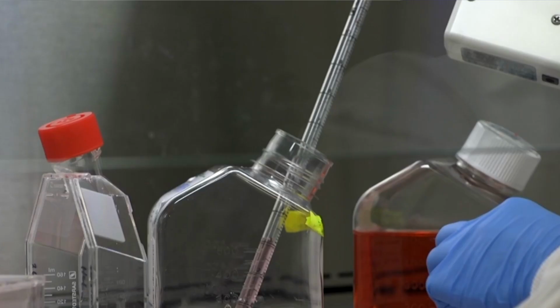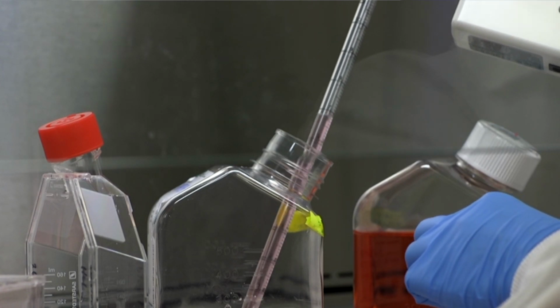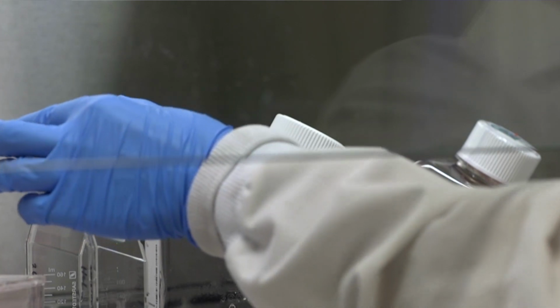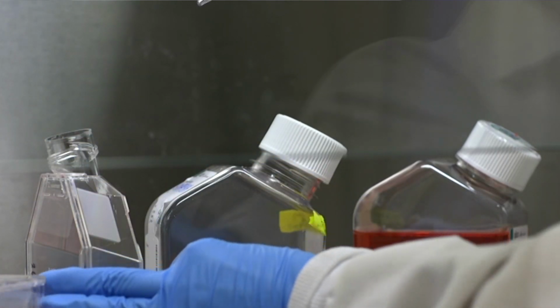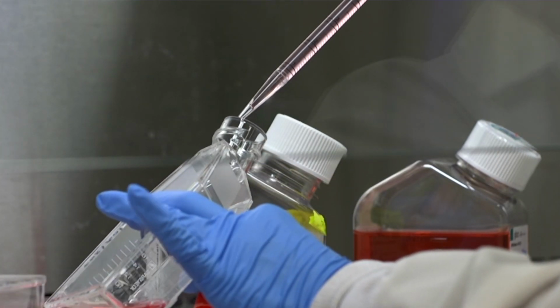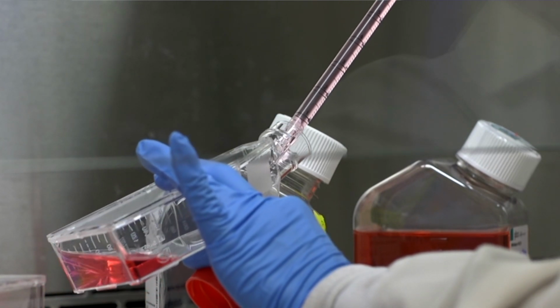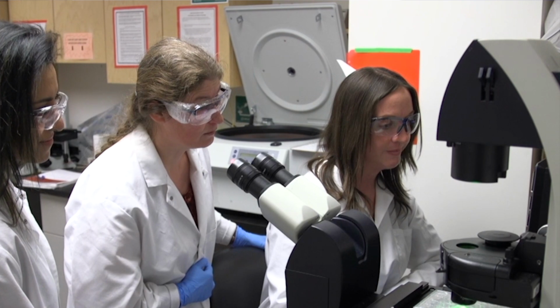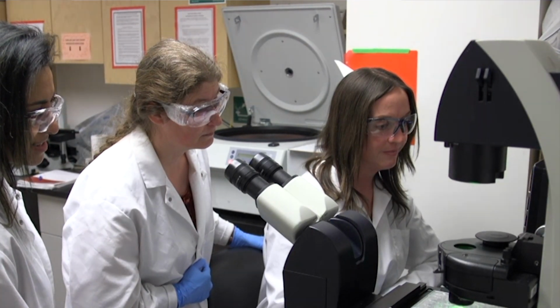Same goes with the chemistry. If you're in the early phase 0 development phase, as we often are, often the design freeze hasn't happened yet. You're experimenting with the formulations and trying to figure it out. And if you're working with a kinetic-based system, you want to be very tight with your tolerances. You can do a lot of early development work and really tighten things up before you get to the design freeze stage.